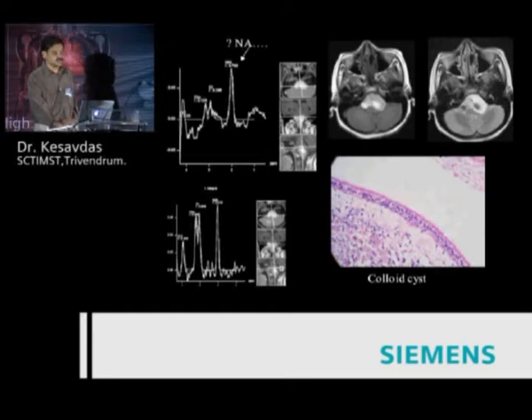That was the question. So, we took the sample of the fluid after surgery, and when we analyzed it, we found out that it is due to N-acetyl sugars, glycosamine, galactosamine, which are responsible. So as you know, it does not give information about a particular chemical, but rather the moiety in which it is there. The N-acetyl moiety is the one which gives a spectra at the 2. So that is how we could find out, and this has been published.